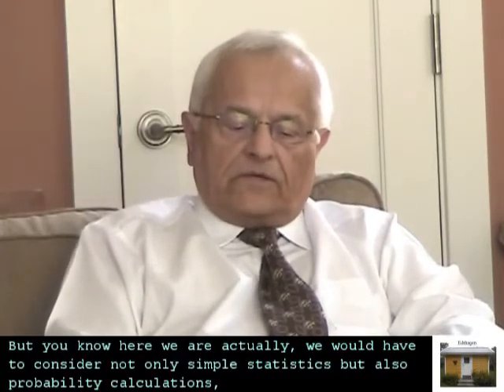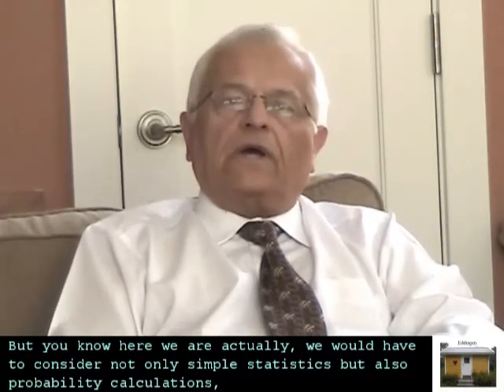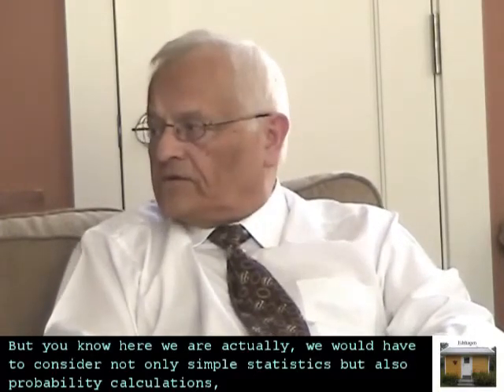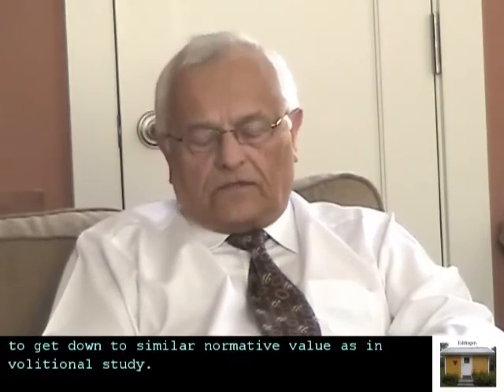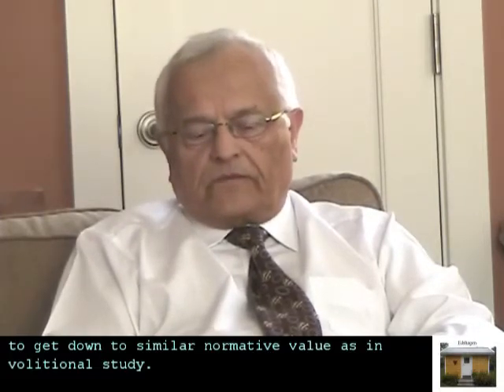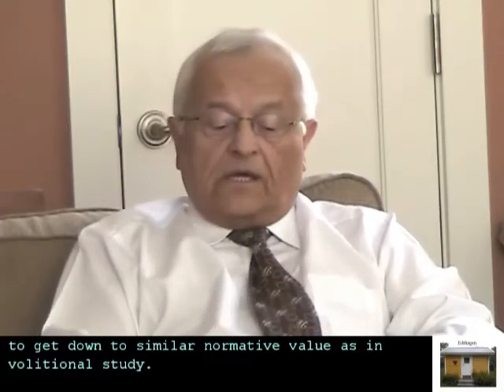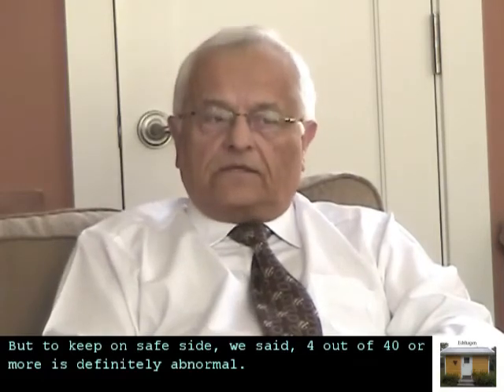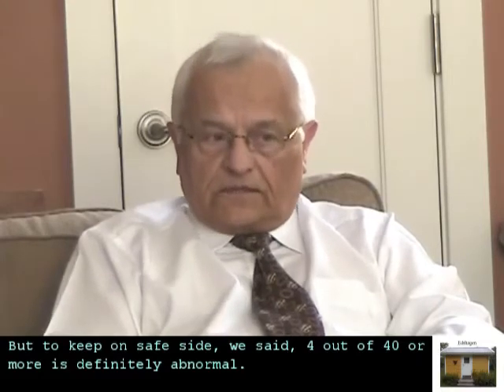But you know, here we would have to consider not only simple statistics but also probability calculations to get down to the similar normative value as in the volitional study. But to keep on the safe side, we said 4 out of 40 or more is definitely abnormal.